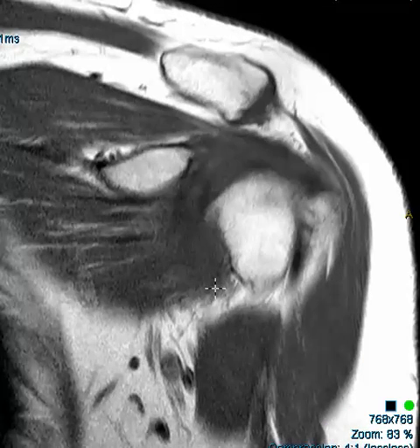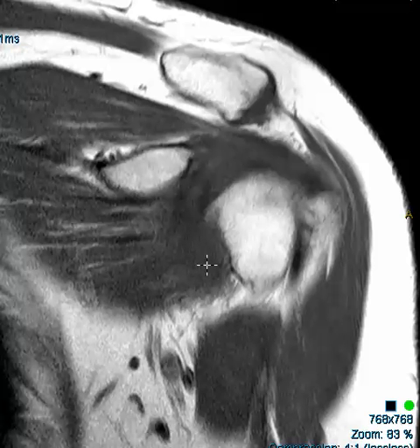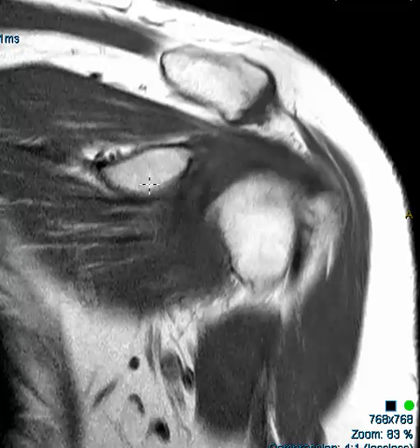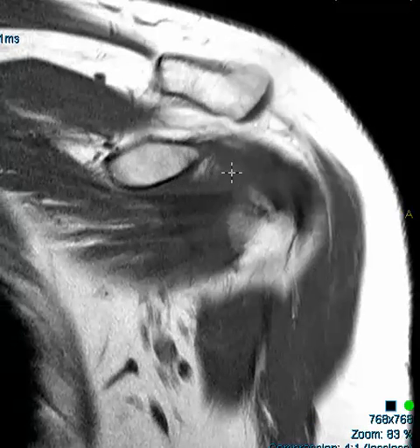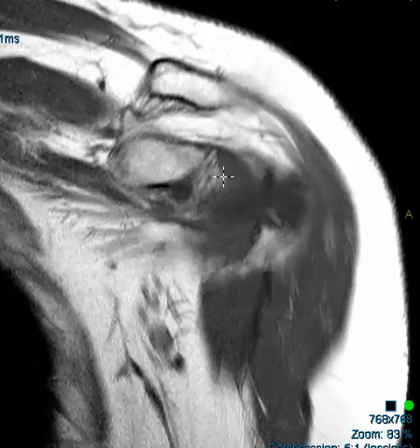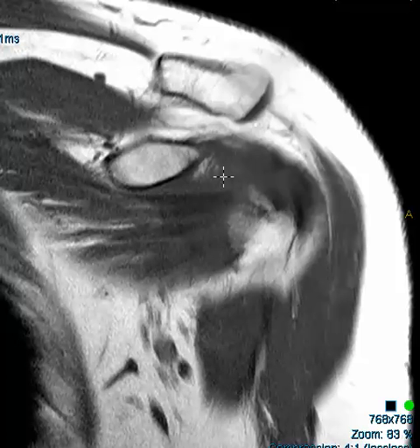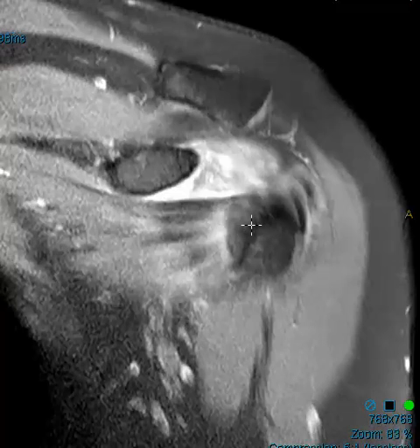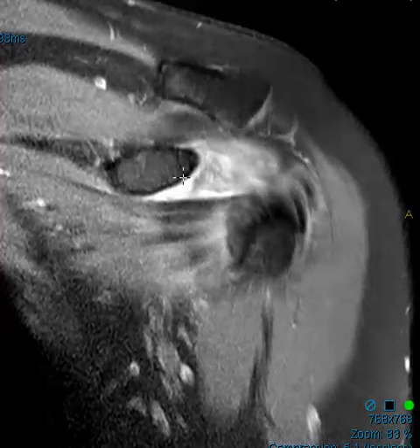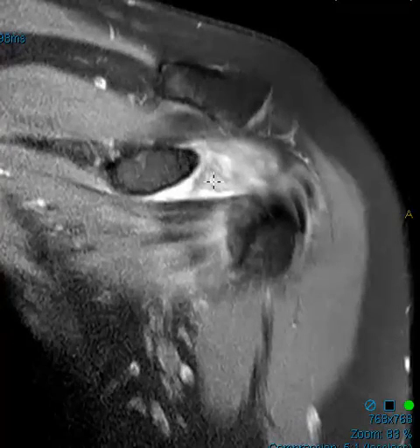Rolling anteriorly, there was some gray fluid signal in the inferior joint capsule. This is the coracoid process. When you're worried about adhesive capsulitis, a couple of things to think about: right here, this little area should have a nice clean area of fat, but in this patient you can see it is just packed in with dark signal on this T1-weighted sequence — something that makes you think about adhesive capsulitis.